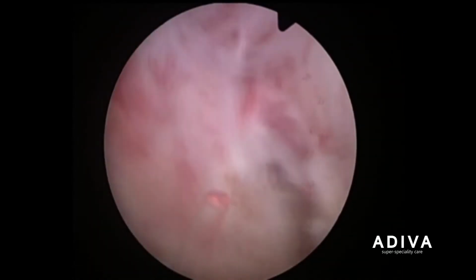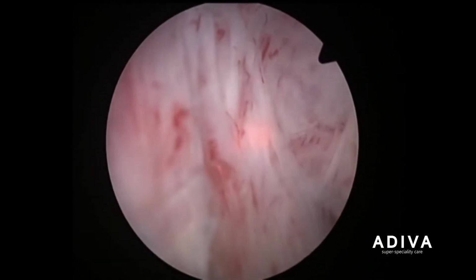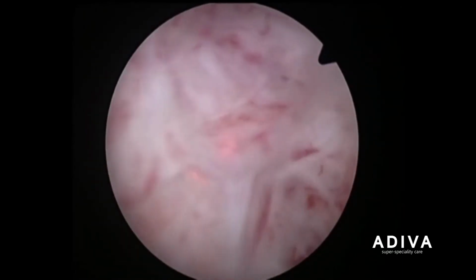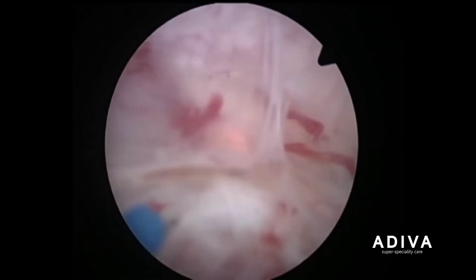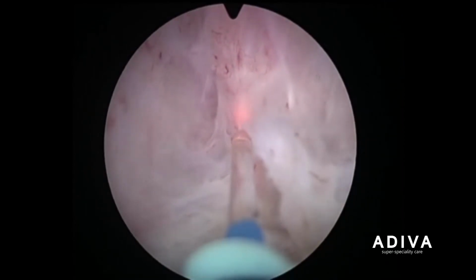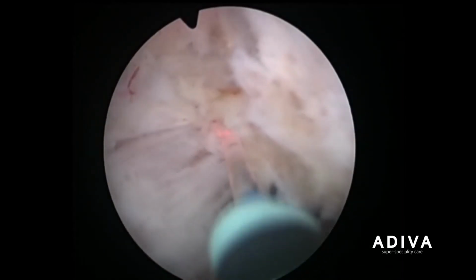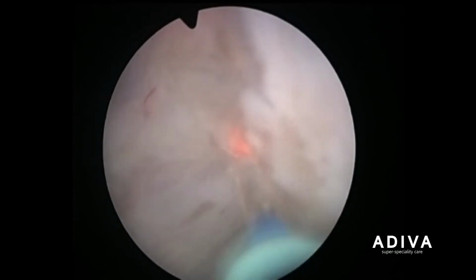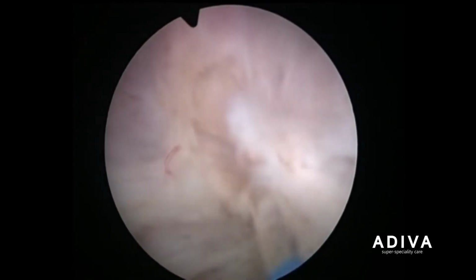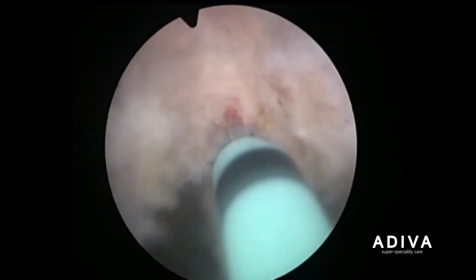Again with the laser, and now the procedure is proceeding and we are able to lift the glandular portion of the enlarged prostate away from the peel. The peel is called in surgical language a capsule. We are going all around because the gland is like a chestnut, and we are able to cut all the fibers very, very clean without any blood loss. The vision is very clear.